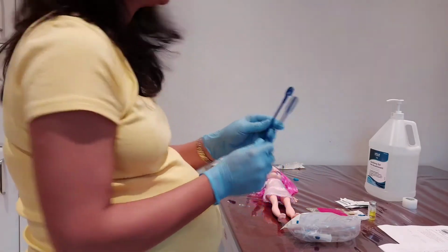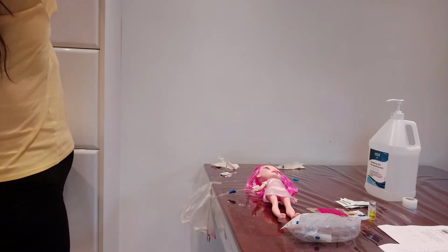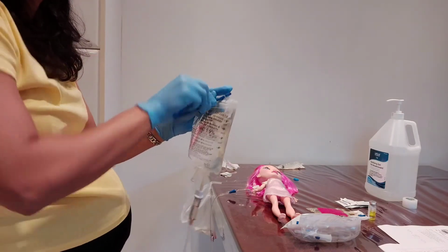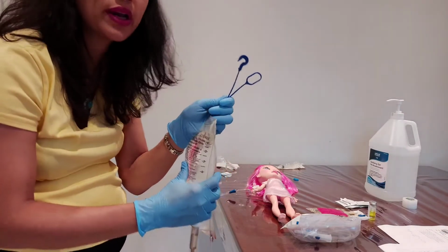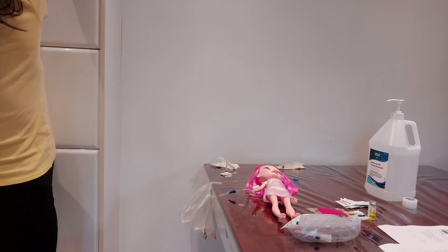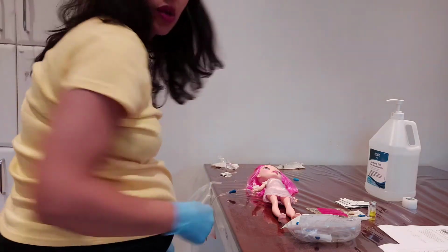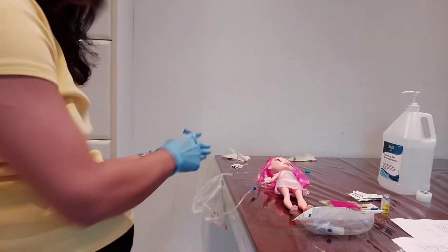I will use the hanger to hang the primary bag. I have to make sure that the mini bag is higher than the primary bag. I will hang it and then I will show you how I put it, and make sure that the primary line now is closed. I will show you. And the primary line is closed now.